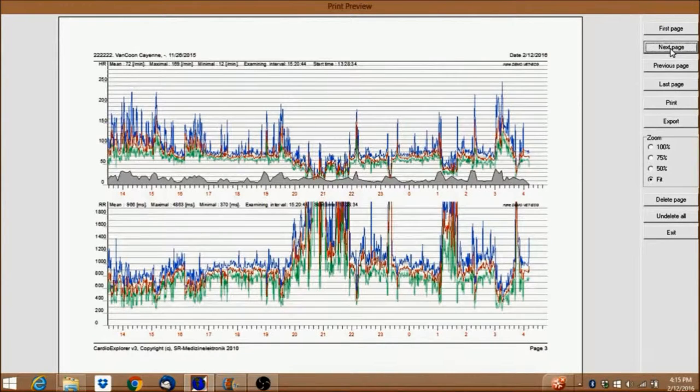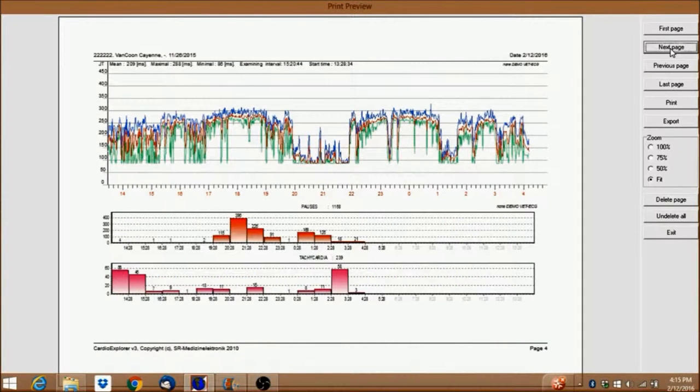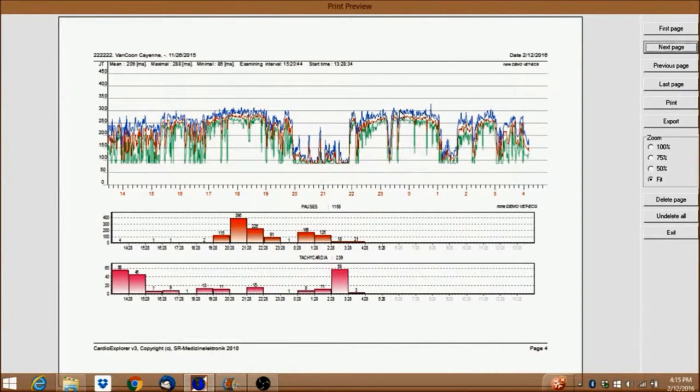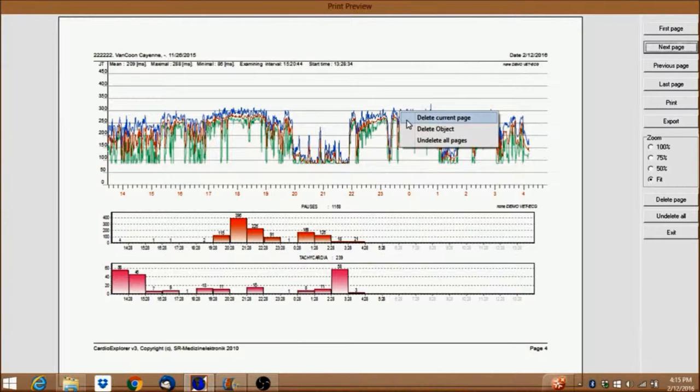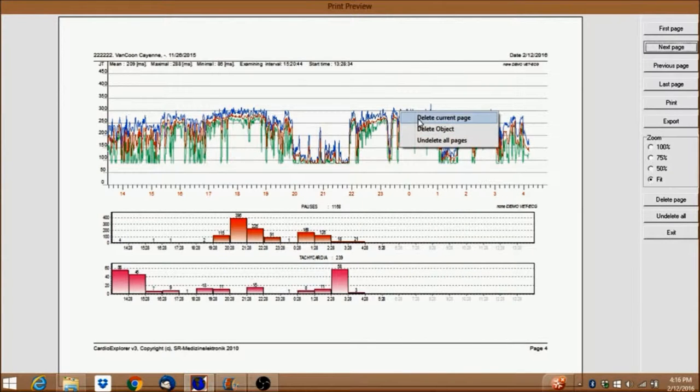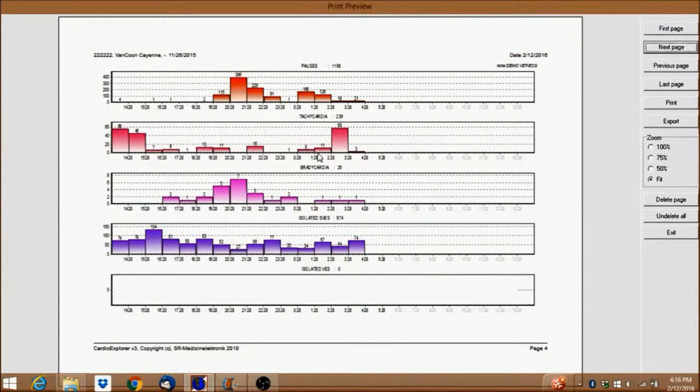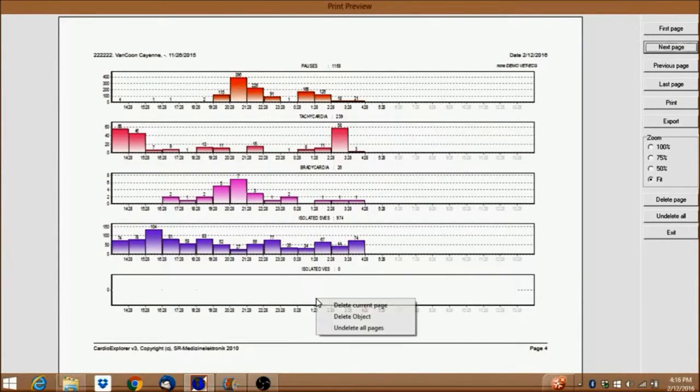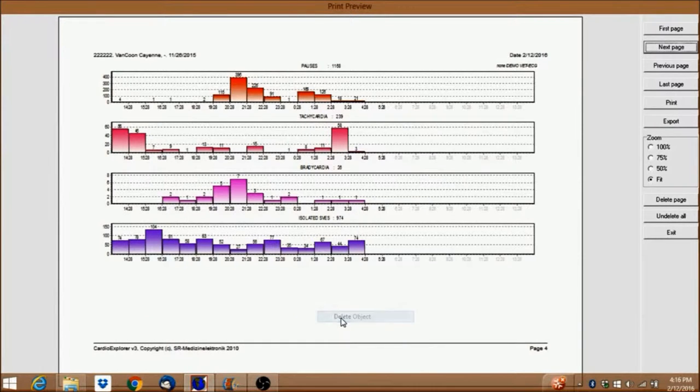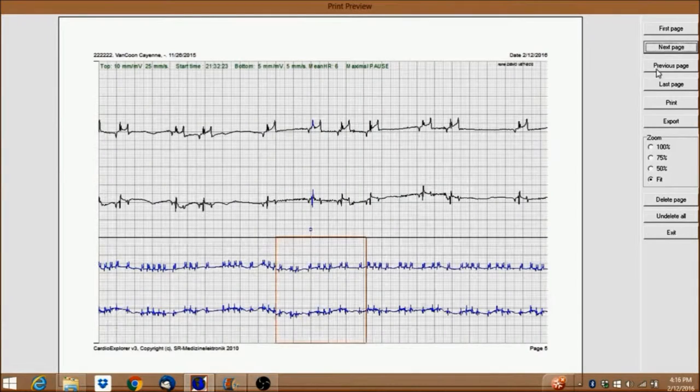You can also delete objects you don't want by right-clicking on the object and selecting Delete Object. When you're satisfied with the report, either print it as a PDF or export it to a Word document.